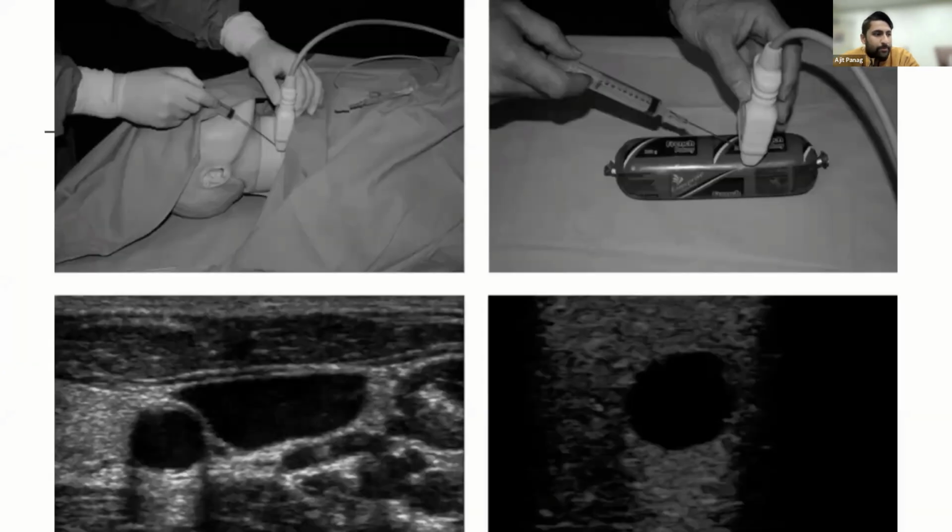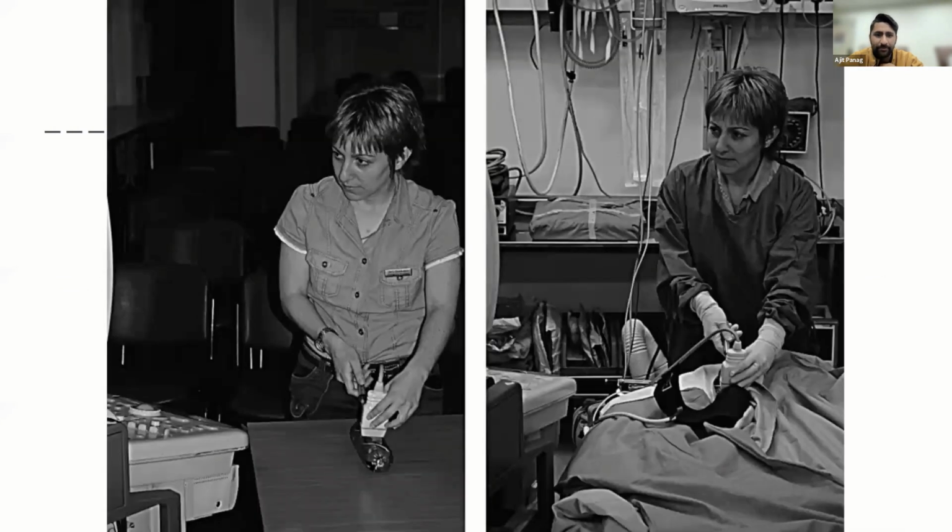So this is a comparison of a high fidelity to a low fidelity simulator. As you can see, the high fidelity on the left shows you the structures around the vessel of interest, in this case the internal jugular vein. That might help someone learn what's around there and what to try not to hit. Whereas the bologna sausage on the right shows you the comparison. So they each have their pros and cons. This is taken from the same paper, the same sausage versus high fidelity model of central venous access.